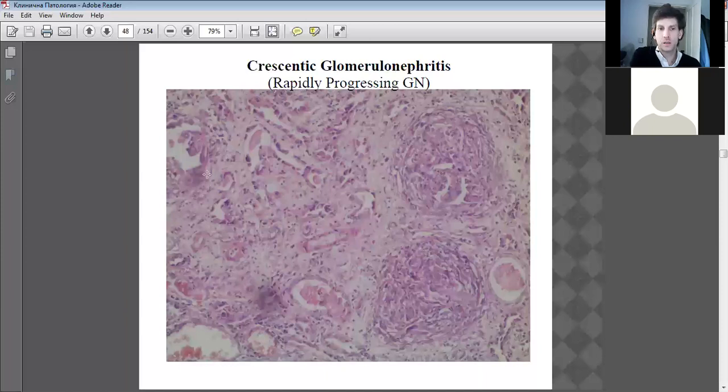Why is the white space around the blood vessels? Oh yeah, this space here, the spaces. It's a luminal space. I don't see any example of a clot there. I think that's just because when the tissue was processed, the erythrocytes clump together, if you like, so they're causing the space. I don't think that's a pathology because the membrane is still intact.